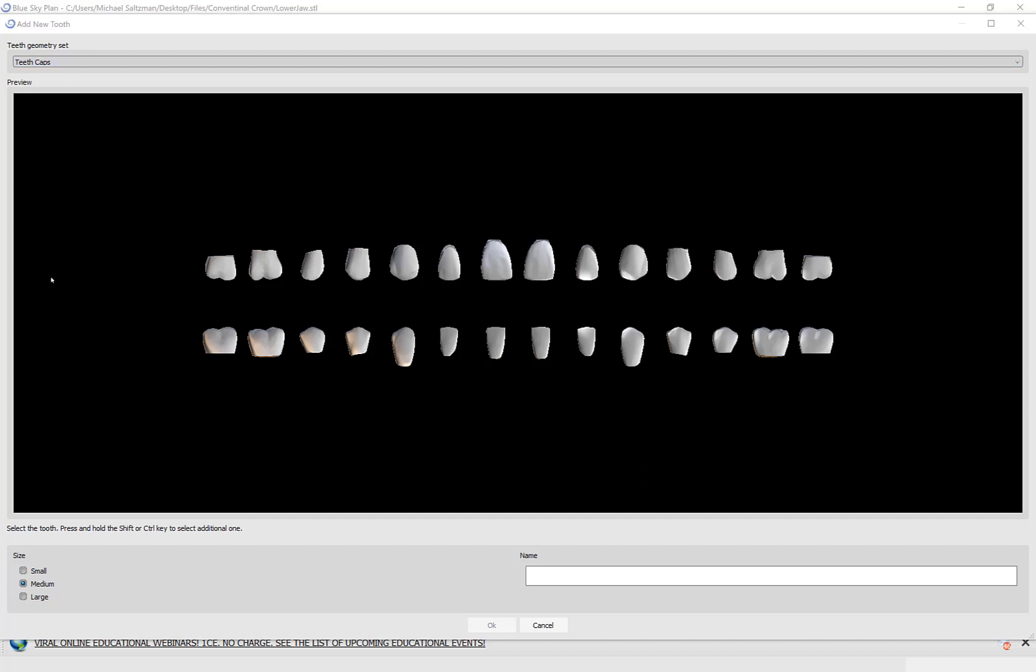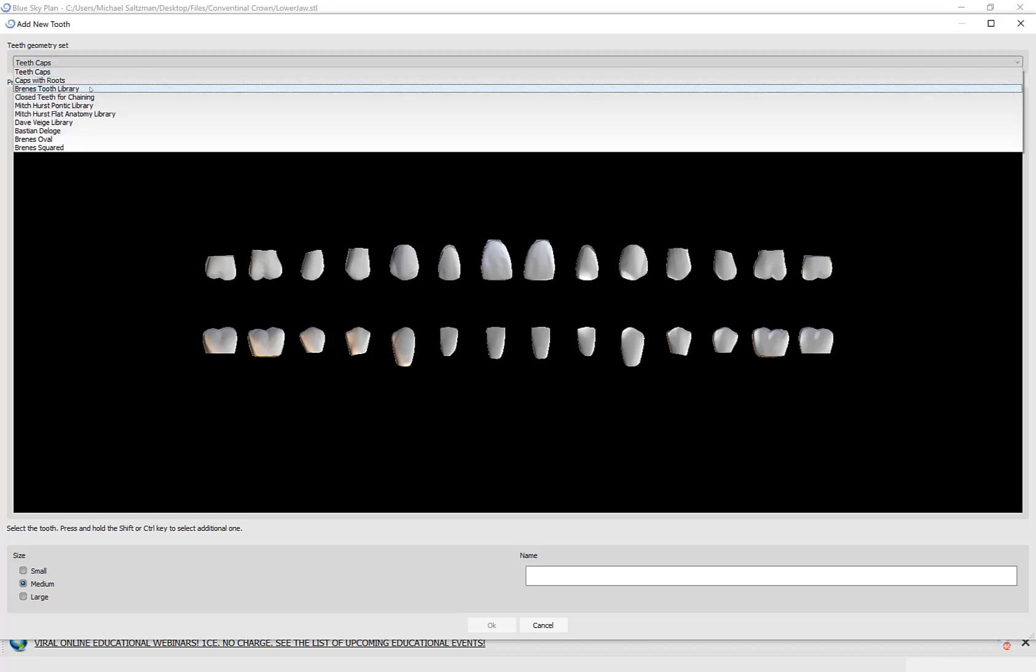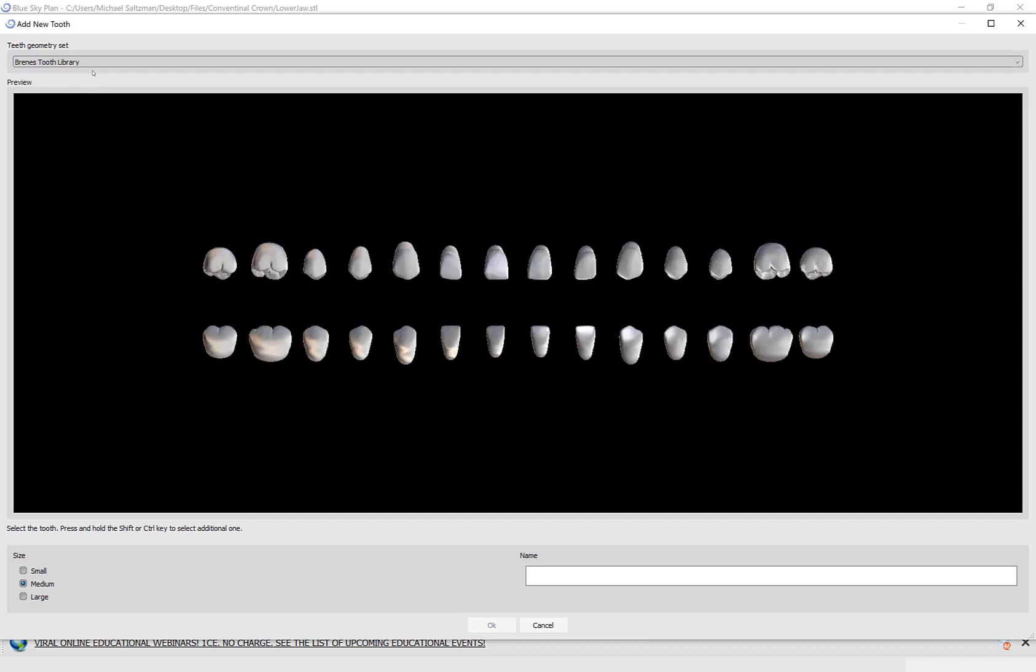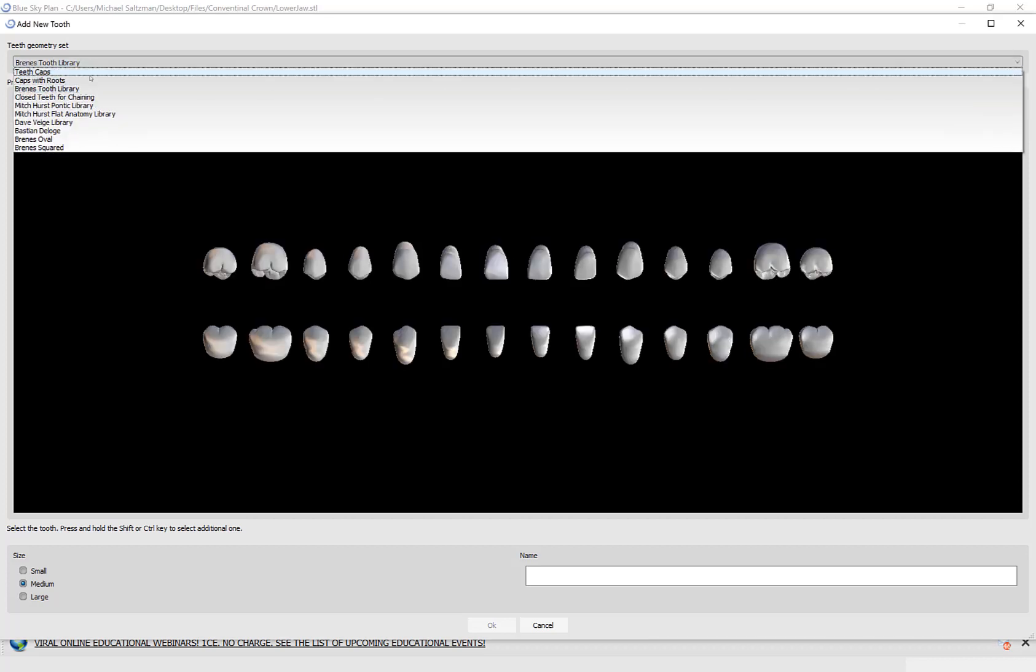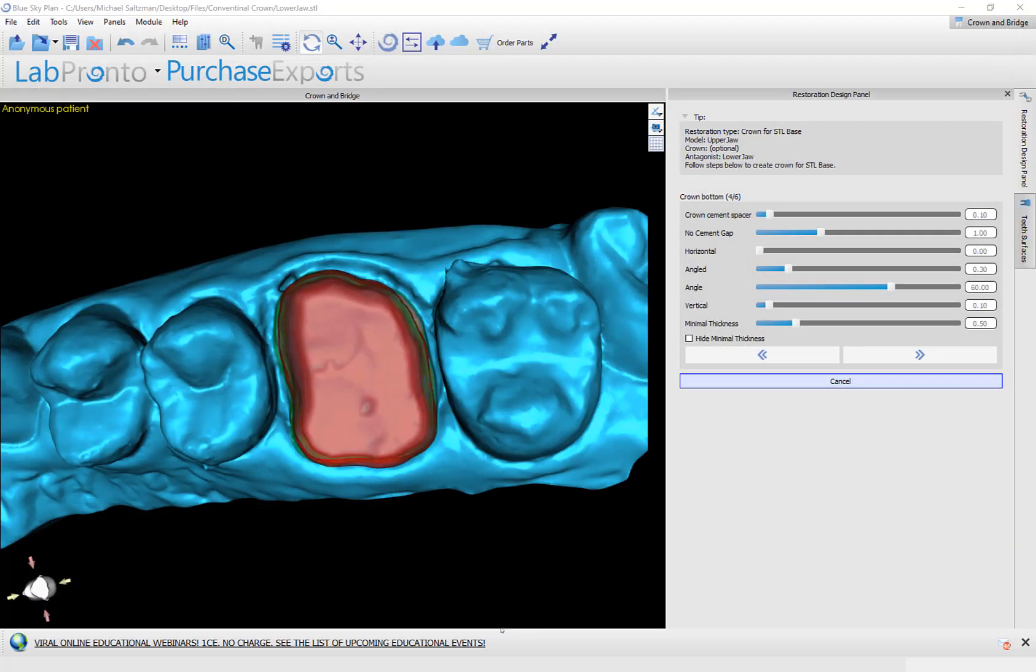The software now asks us to select the relevant tooth. We have a variety of different tooth libraries that you can choose from. Go ahead and left click on the relevant tooth, select the general size in the bottom left, and then click the OK button.